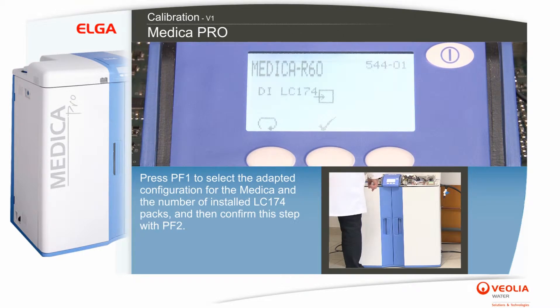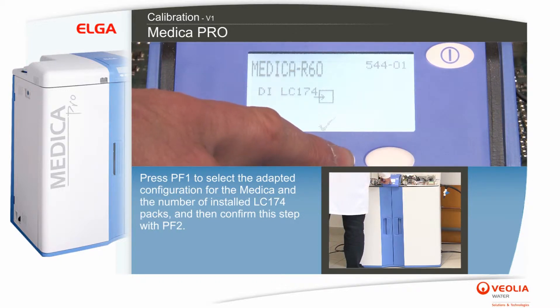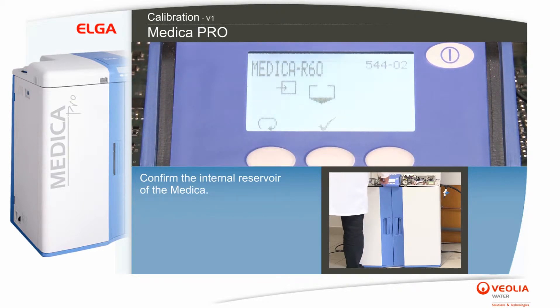Press PF1 to select the adapted configuration for the Medica and the number of installed LC174 packs, then confirm this step with PF2. Confirm the internal reservoir of the Medica.